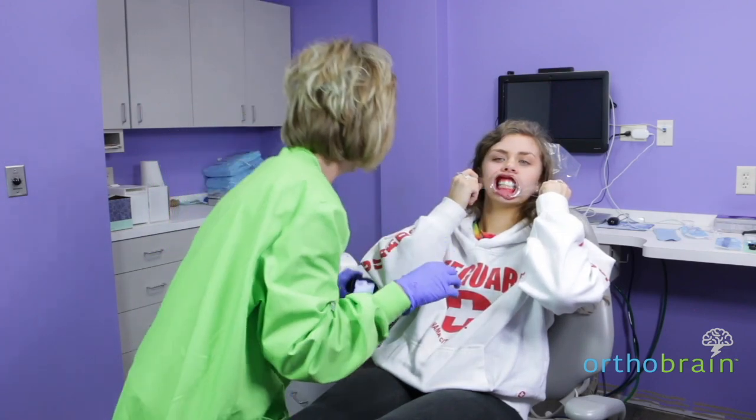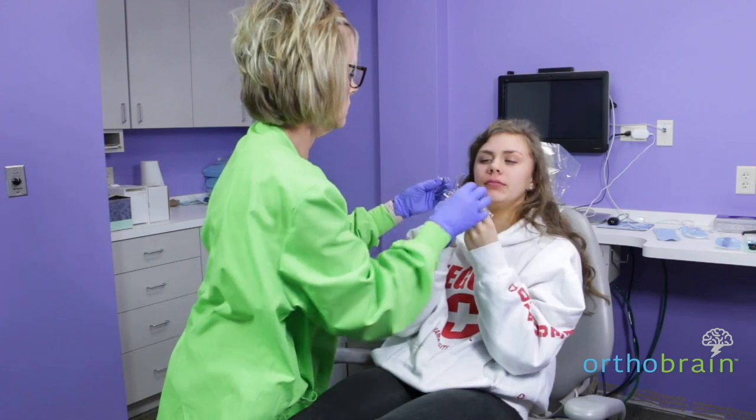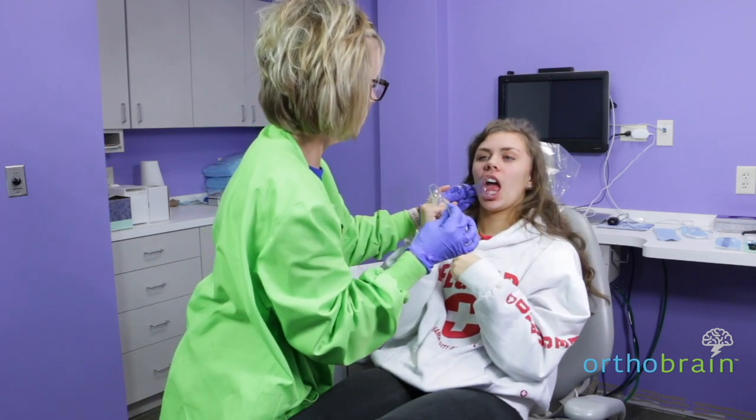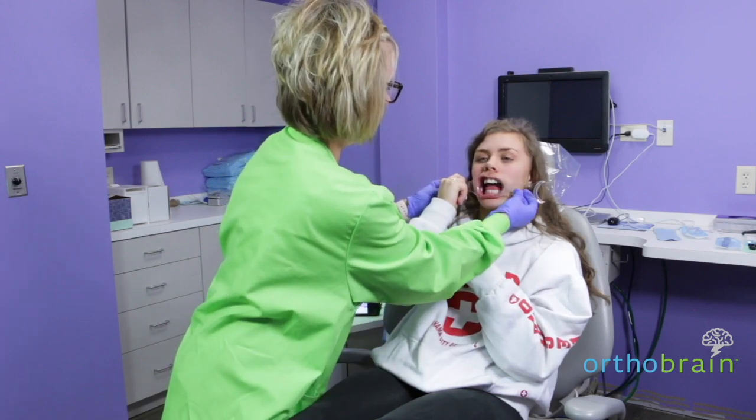Now we're going to switch them around. Put the larger end on this side. Put that in for me and hold that. Let's put this one in and hold that.